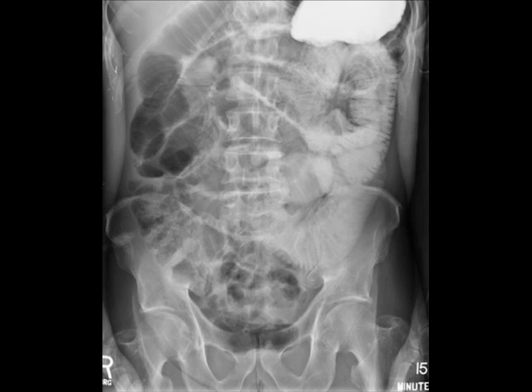On the 15-minute image and on every image thereafter, the cassette will be centered to the level of the iliac crest. The stomach is no longer needed, and the inferior portion of the abdomen may show contrast movement. Timestamps in the form of lead markers or computer annotation should be used.